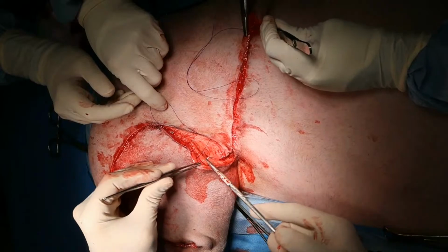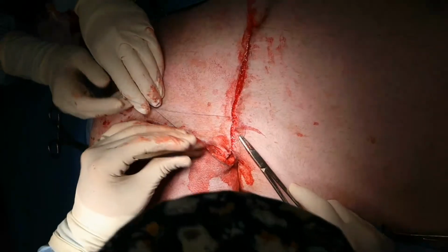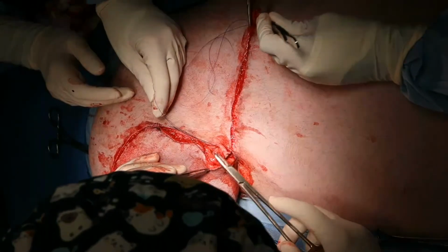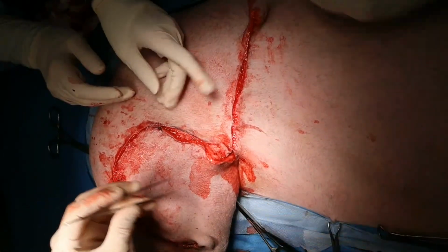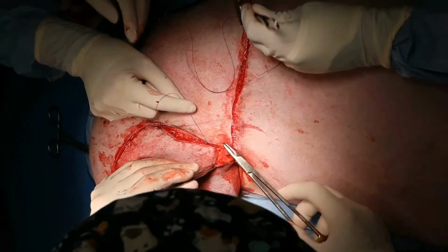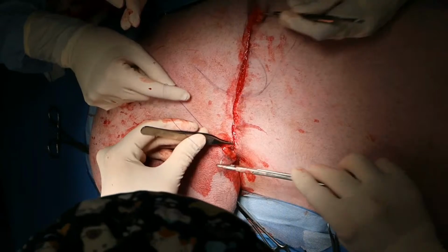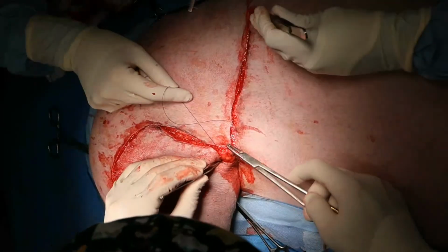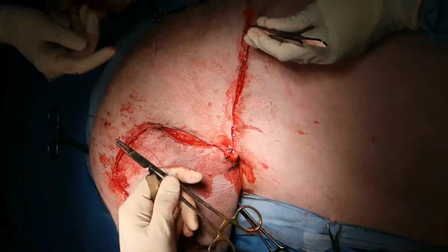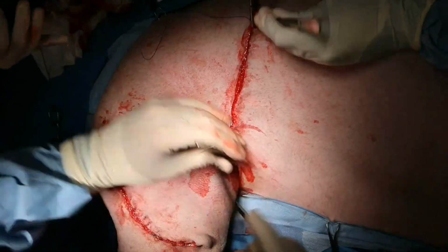You know what? Can I get a couple of sterile skin staplers, please? I normally don't love skin staplers, but this skin is nice and thick, and so I think the skin staples will hold quite nicely. Awesome, thank you. Hold on that for a second, please.